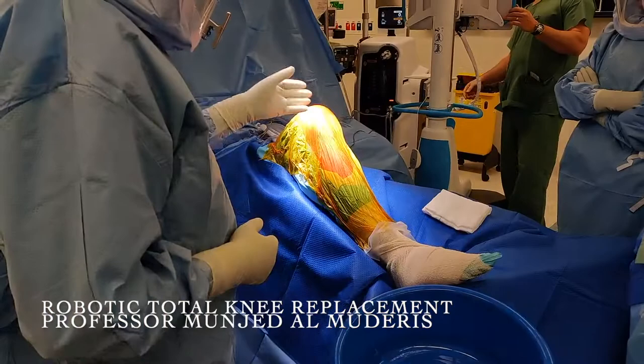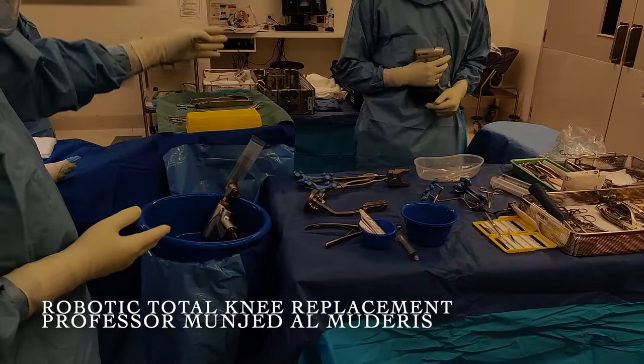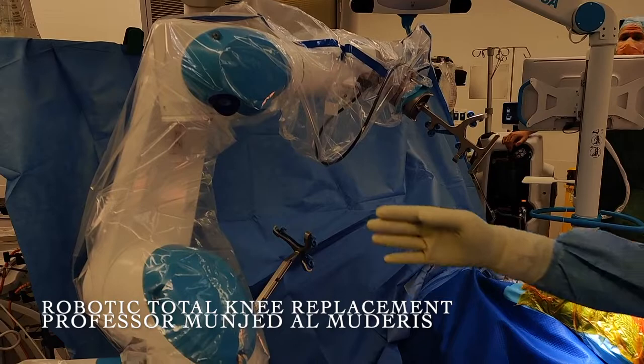The patient is positioned supine with holders underneath the knee in a flexion position. The table is set up in a U-shaped manner where the scrubbers have access to all instrumentation at ease, focusing on the surgical field. I use one or two assistants and the robotic arm has access to the field from the proximal end.